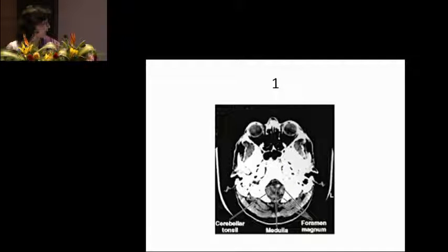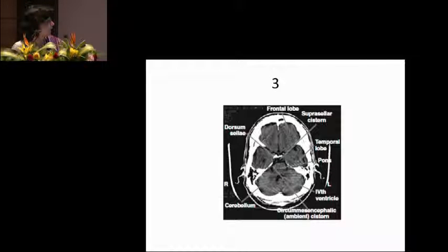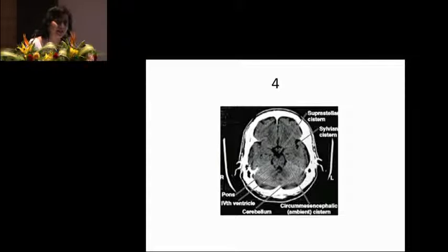The first level is the base of the skull, where you can start seeing the medulla and the cerebellar tonsils. As we go up, that's the cerebellar level — you can still see the cerebellum, but the temporal lobes start to appear, along with the ethmoid and sphenoid sinuses, the mastoid air cells, and the external auditory meatus. In a fracture of the base of the skull, you'll see blood here. The third level is the higher pons level — the pons has appeared, along with the frontal lobes, temporal lobes, and cerebellum. You've also started to see the fourth ventricle and the suprasellar cistern, just behind the dorsum sellae where you'd expect the pituitary and the circle of Willis. Higher up, you see the suprasellar cistern, the sylvian cistern, the fourth ventricle, and the circummesencephalic cistern — all important because they get compressed as brain pressure rises.